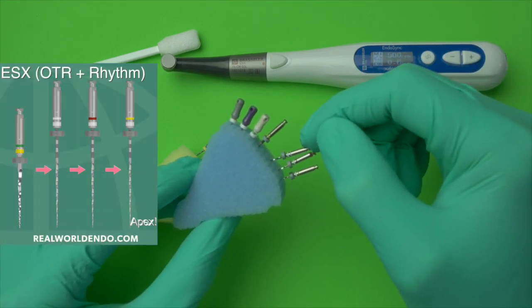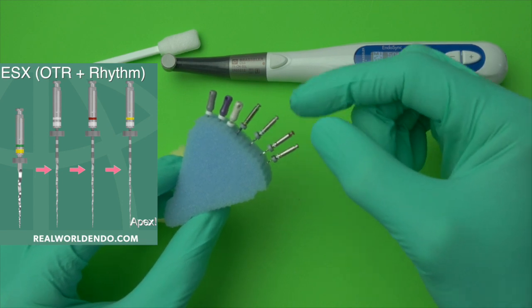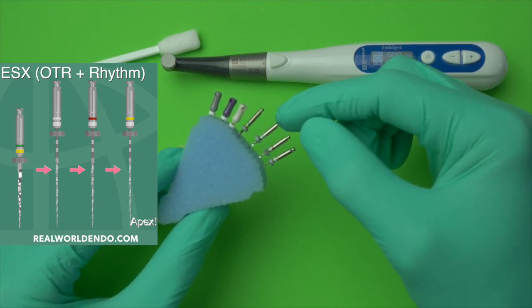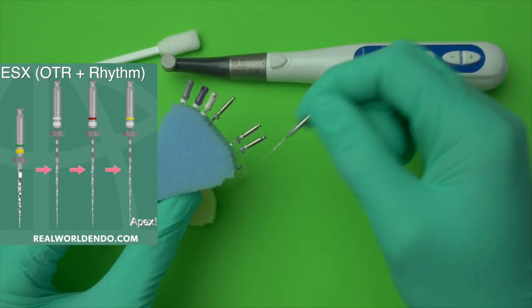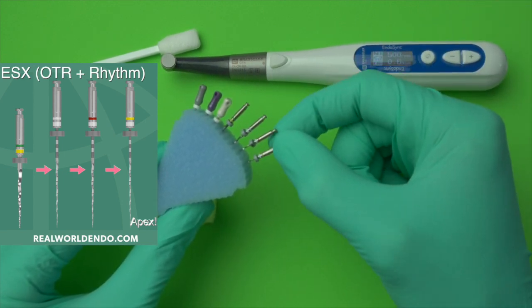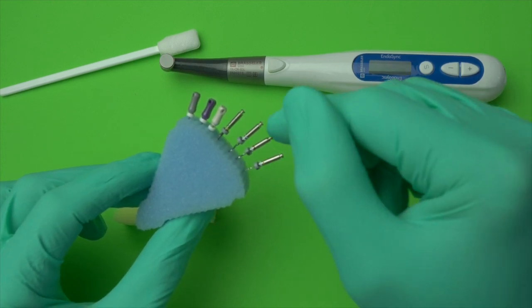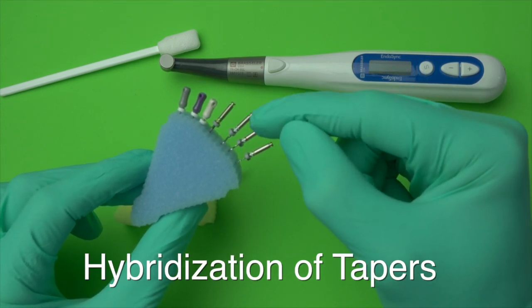What's left is the apical one-half of the root. You want a stainless steel hand file to create a path first, then follow with the rotary files. For the apical half, you have three files with the same tip size — 1505, 1504, and 1502 — to create what I call hybridization of tapers: same tip size with different tapers. You do rhythm motion: 1505 three strokes out, wipe; 1504 three strokes out, wipe; 1502 three strokes out, wipe. At this point the 1502 is right down at the apex, and you've connected the handpiece to the EndoSync AI to measure working length with the 1502 simultaneously.